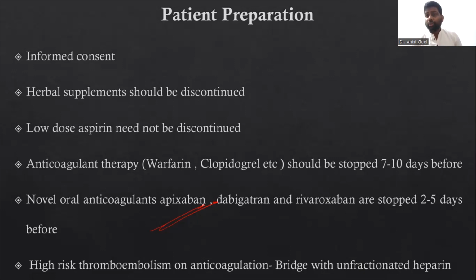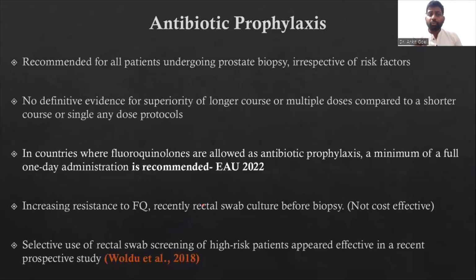Now, one of the most important things regarding patient preparation is the antibiotics, which is most of the time under discussion. So we'll talk about a few important points about antibiotic prophylaxis. We have to give prophylaxis to all the patients irrespective of whether the patient has risk for infection or not.